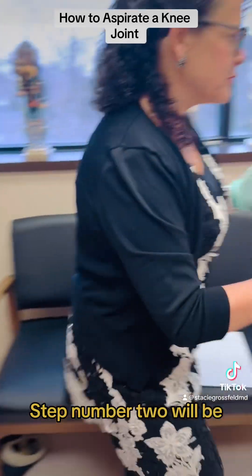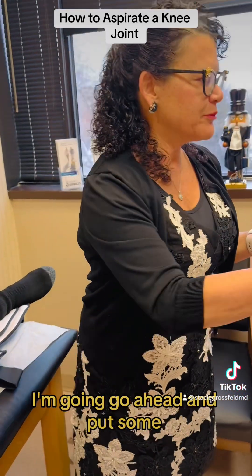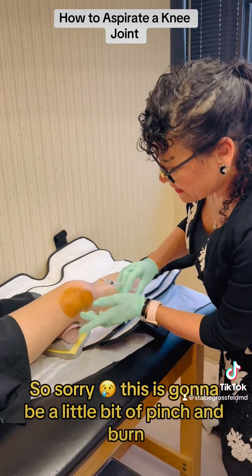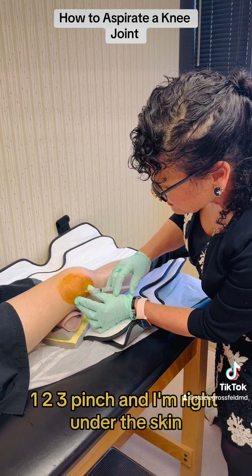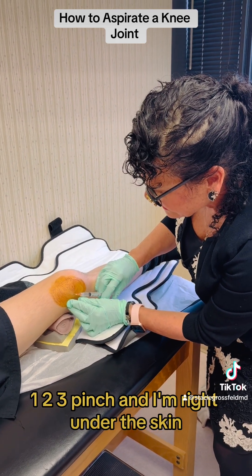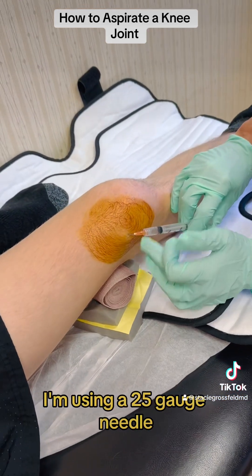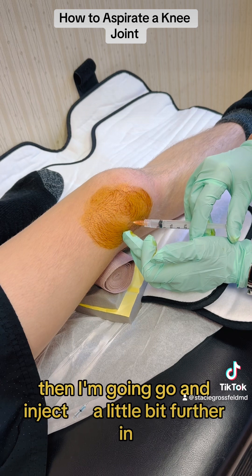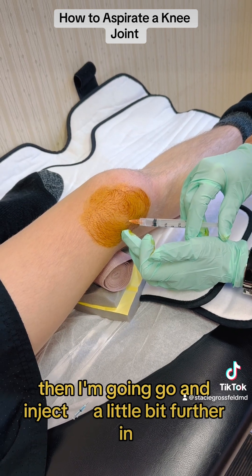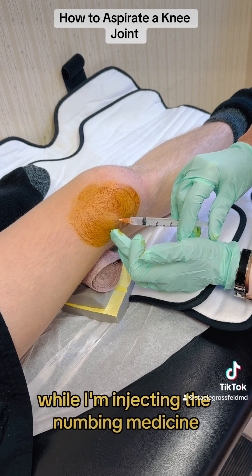Step number two: I'm going to go ahead and put some numbing medicine in. This is going to be a little bit of pinch and burn — one, two, three — and I'm right under the skin and you can see the welt come up. I'm using a 25-gauge needle so hopefully it hurts the least amount. Then I'm going to inject a little bit further in and get the capsule of the knee while injecting the numbing medicine.